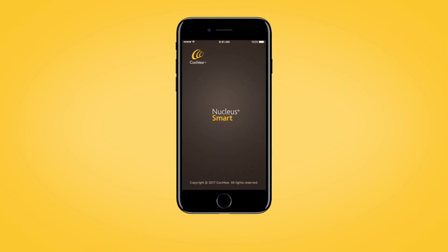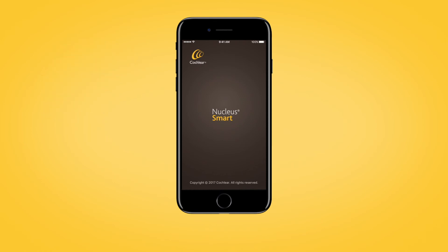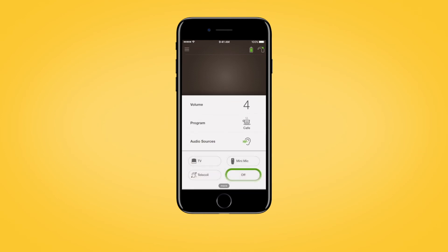When your Nucleus 7 is paired with a compatible Apple or Android device, you can also control streamed audio using the Nucleus Smart App. Open the app and tap the audio sources on the app home screen. In the audio sources control panel, tap the icon for the audio source you want to use. Tap off to stop streaming audio and return to the previous program.